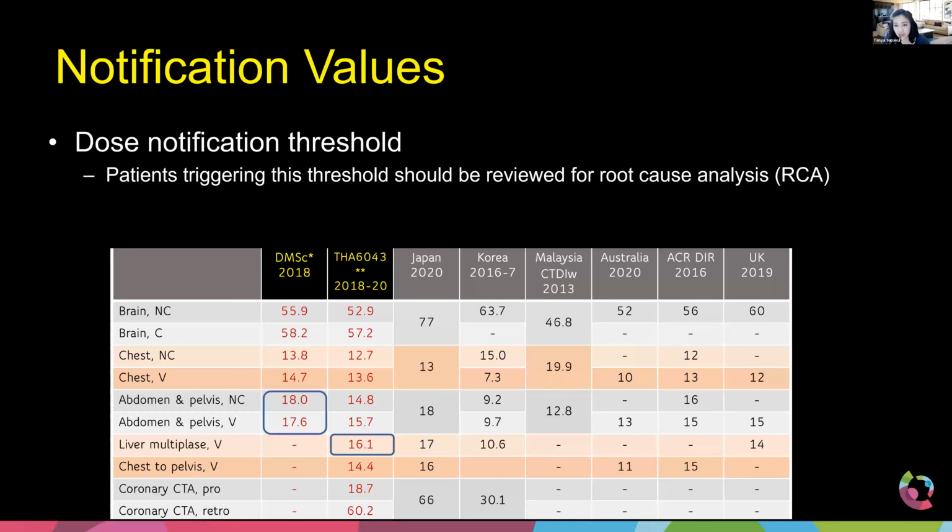At least we have some data collection, and she talked about a limitation that for the prospective studies, the number is low. Maybe because we have high-end technology, and also the radiologists monitor the patients by themselves, almost every patient, and this is in the academic hospital. So we are very careful on image quality and radiation dose. But at least it's a first step for us to watch and to learn the process.